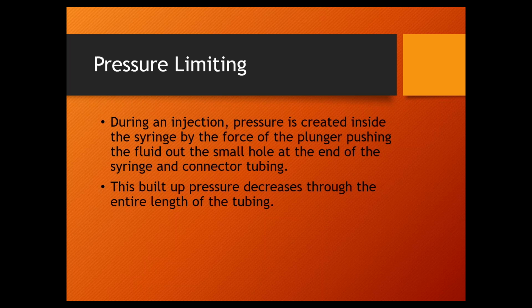If you guys are BMETs, if you work on infusion pumps, the occlusion alarm for infusion pumps is typically what, 12 psi, 10, something like that. Very, very low. On an infusion pump, if it hits 10 or 12 psi, it stops the infusion, alarms go off, nurse call goes off. But that's for an infusion pump. So no, 300 psi, that pressure limit is saying in the syringe, don't exceed 300 psi in the syringe.